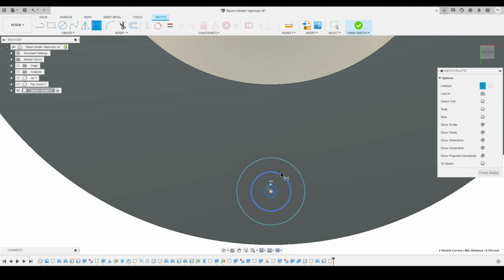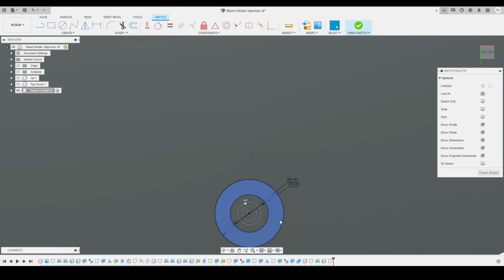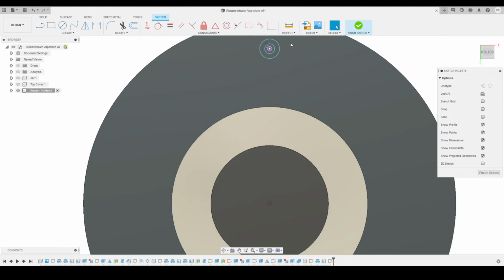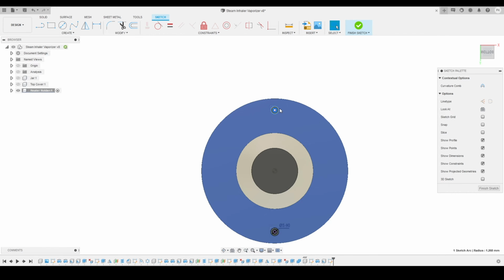Now I will define the dimension of the circles. So this one is 3 mm, and the outside one is, I think it will work as a 7 mm. No, sorry, 5.4 millimeter. Here you can see. So this is what we got so far, and what I will do, I will just select these circles and will apply the equal constraint. So these two circles also become equal to the bottom circles. So I will just select the circles and will apply the equal constraint.